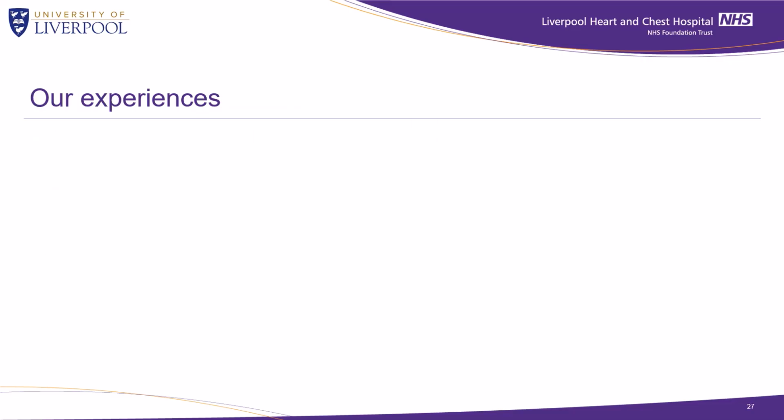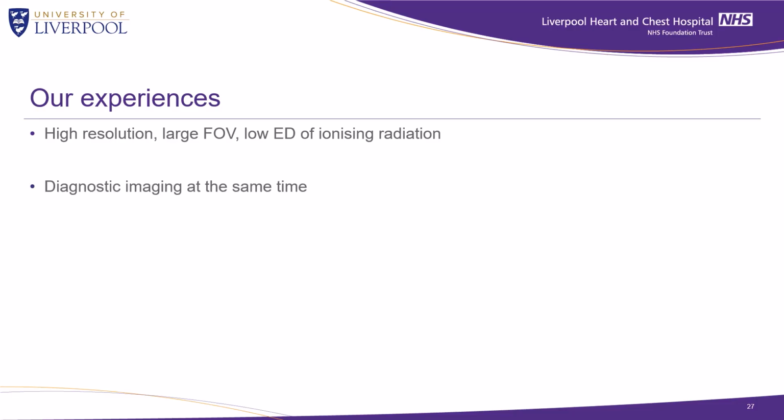Overall, we have found DDR to be very useful. It represents a reduction in ionizing radiation dose compared to traditional fluoroscopy or CT. It has a good resolution as well. It also produces diagnostic imaging of the chest.